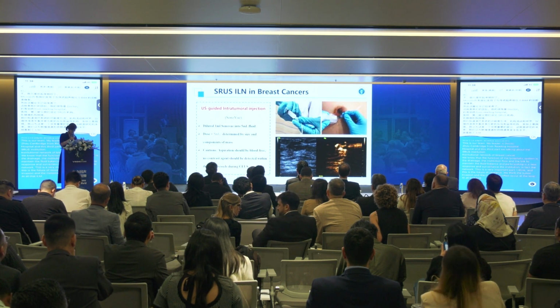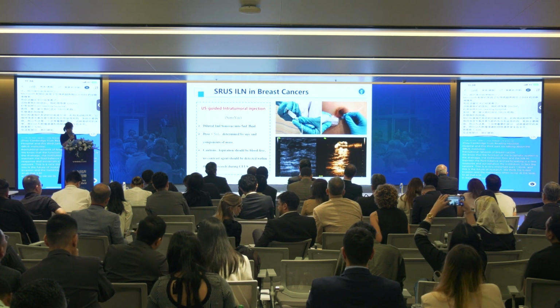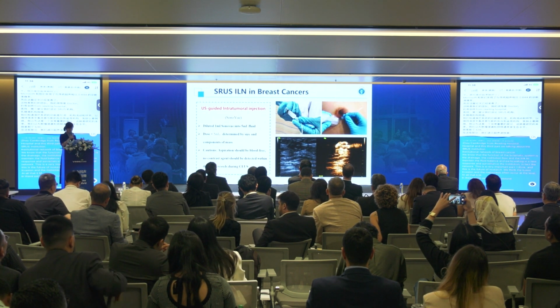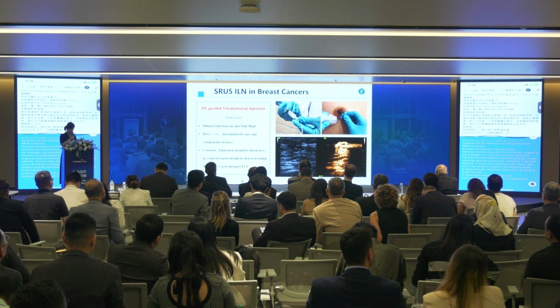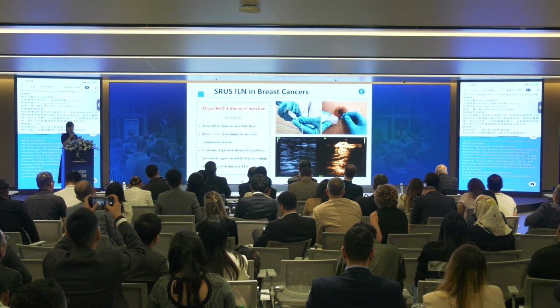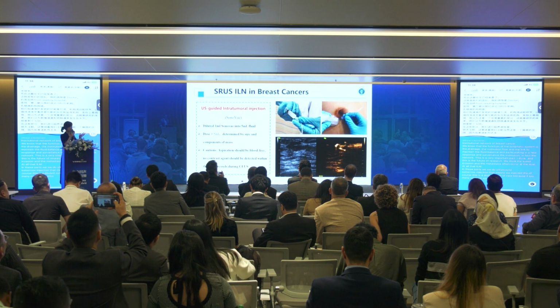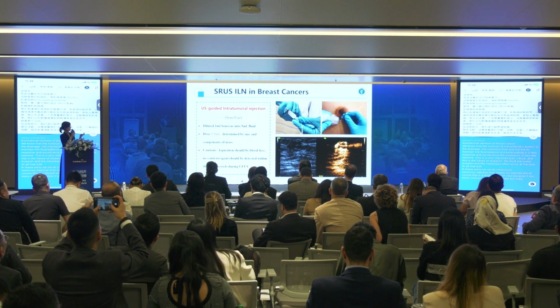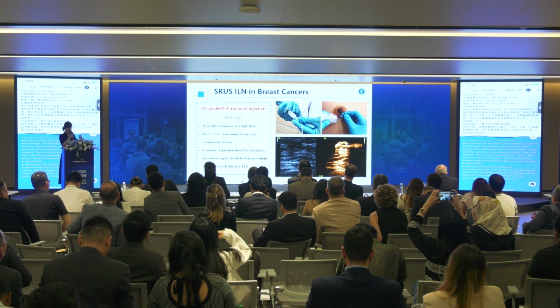In this part, we do ultrasound-guided intratumoral injection. That means we inject Sonovue. Of course, this is diluted Sonovue, because if there are too many contrast agents, it will make too many signals. That just makes confusion.